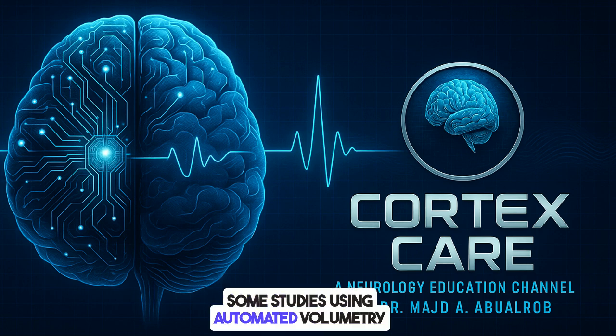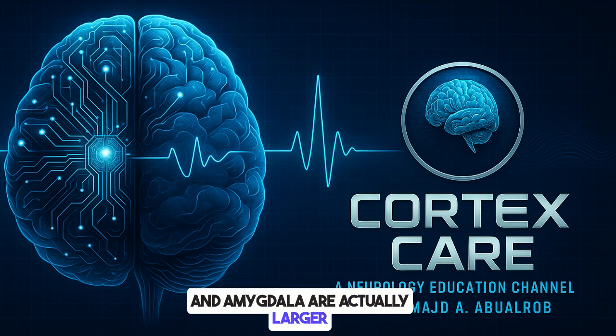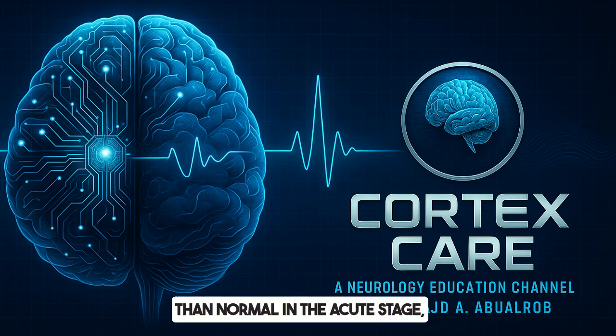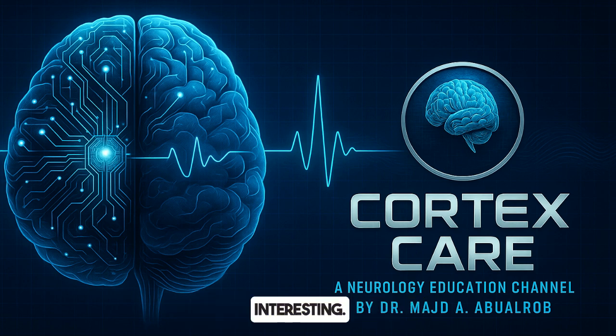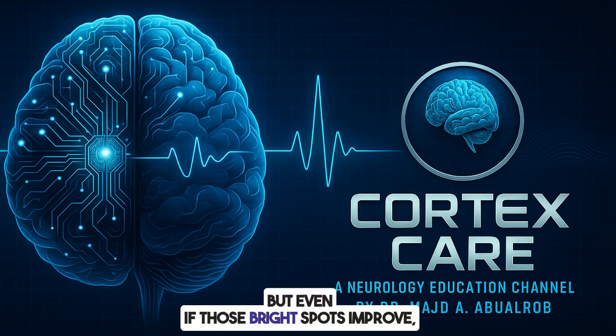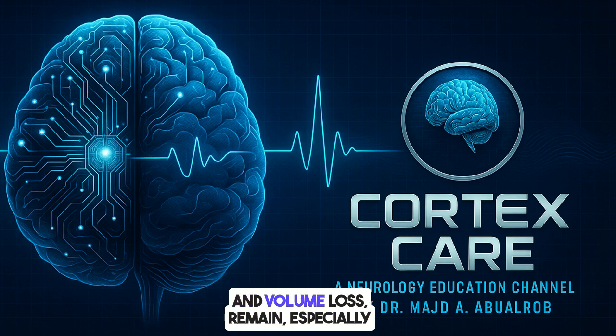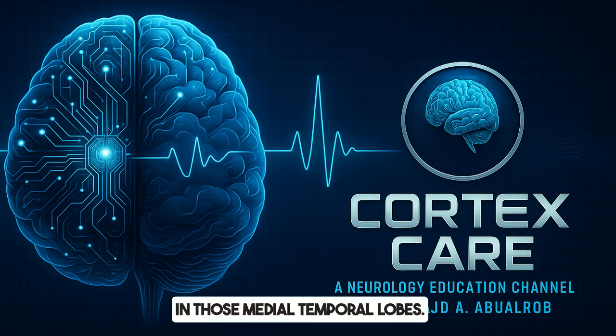Some studies using automated volumetry have even found the hippocampus and amygdala are actually larger than normal in the acute stage, probably due to that swelling. Interesting. What about follow-up? Does the swelling go down? Any lasting changes? The swelling usually resolves, yes. But even if those bright spots improve, often significant sclerosis, which is like scarring and volume loss, remains, especially in those medial temporal lobes. So lasting damage is common.